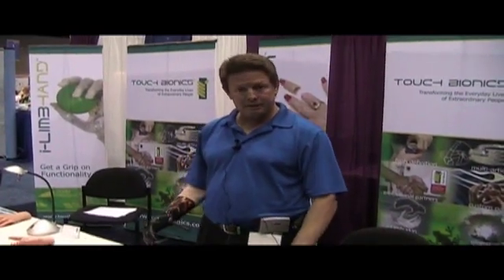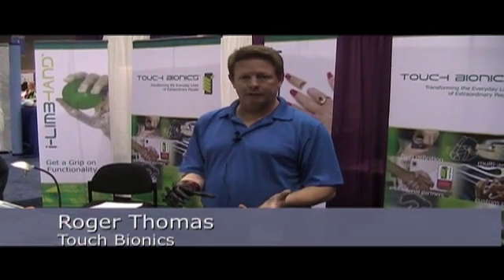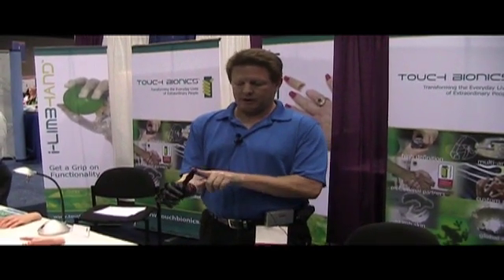My name is Roger Thomas, I'm with Touch Bionics. What I'm demonstrating today is the i-limb. It has five movable fingers and the thumb actually rotates over and back.